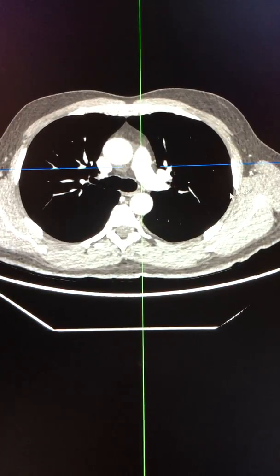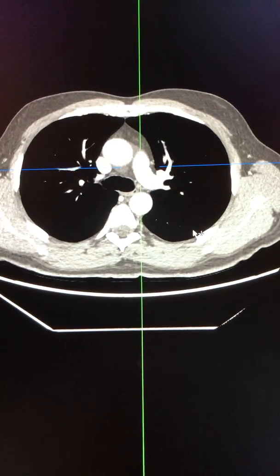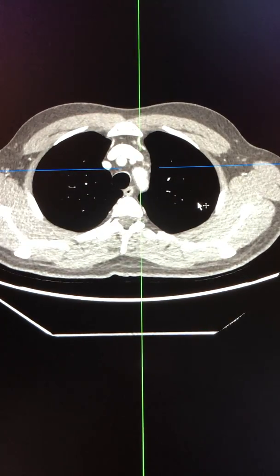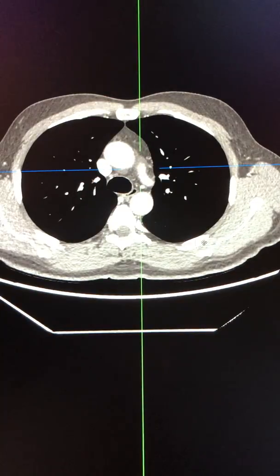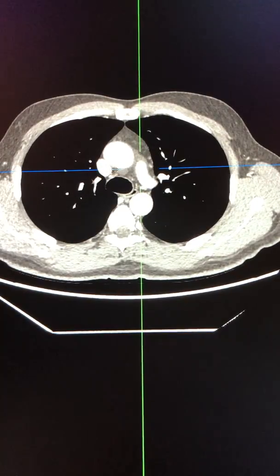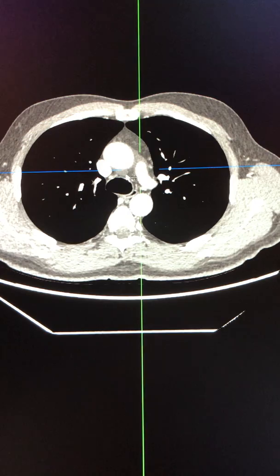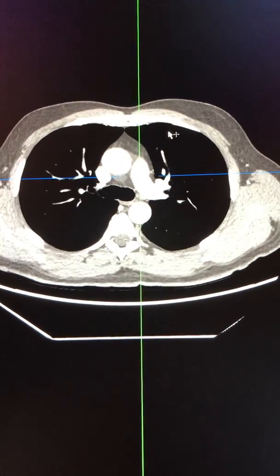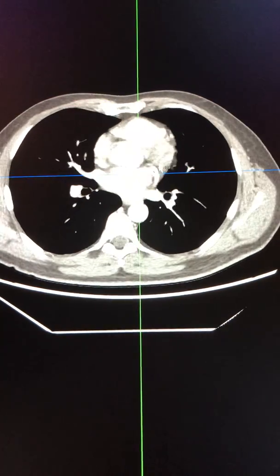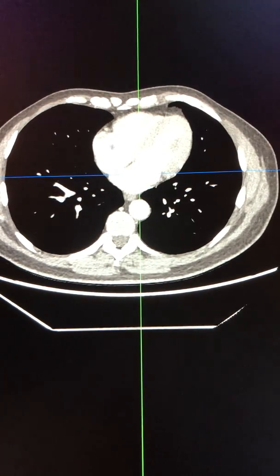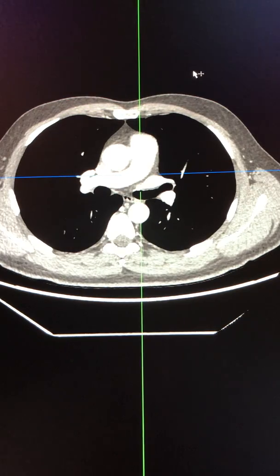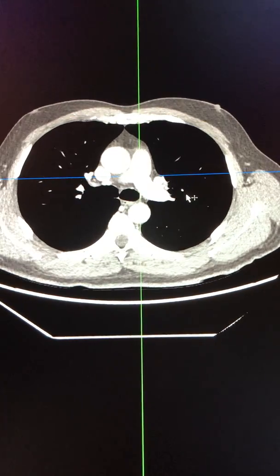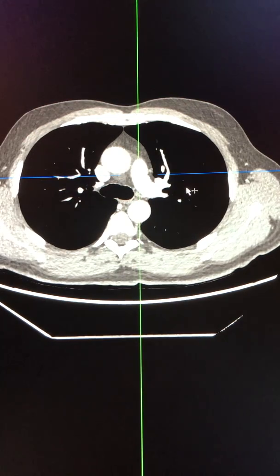In this video we will be looking at another common pericardial recess: the superior aortic pericardial recess. Fluid in the pericardial space in the superior aortic region can accumulate in normal individuals. This can occur in the absence of any circumferential pericardial fluid. The superior pericardial recess can be further divided into the anterior and posterior compartments.